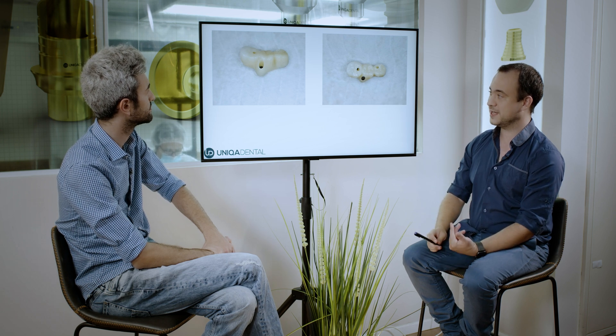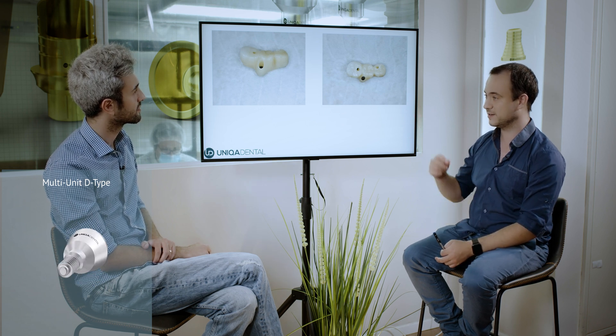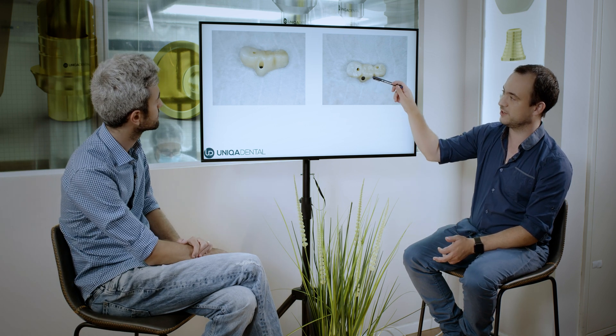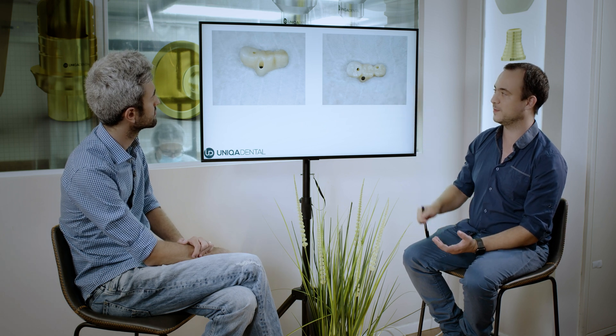You can see that the two normal screw channels are very small, and this screw channel is a little bit bigger. That's because here you can see a one-and-a-half millimeter sleeve. When using a one-and-a-half millimeter sleeve, the screw is in the bridge material itself — it's not in the sleeve. So you can't have a floating screw in the bridge; you need to take the screw from outside, put it in, and close it there.